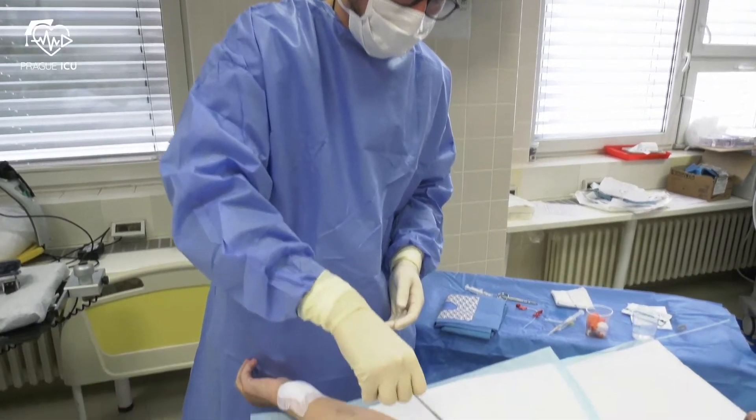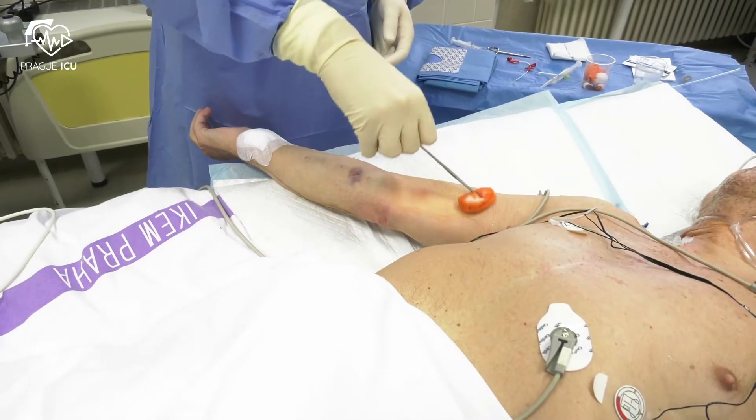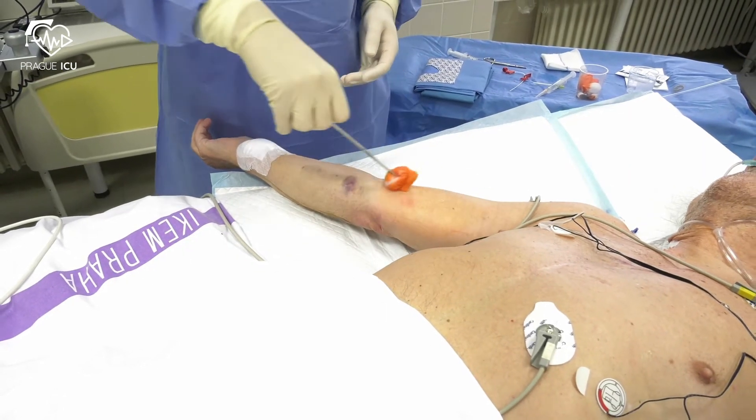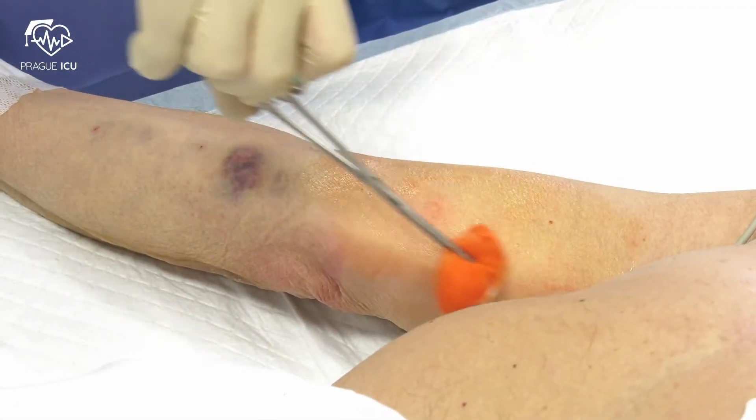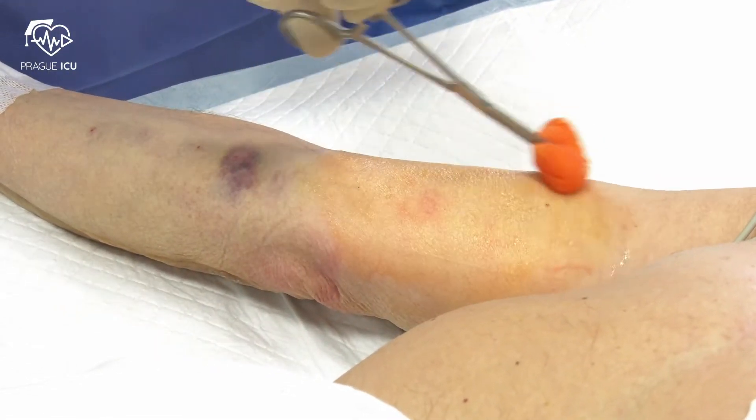Setting up of a sterile trolley for arterial line insertion was demonstrated in our previous video. First, apply aseptic skin prep widely around the insertion site, starting from the center and moving out.